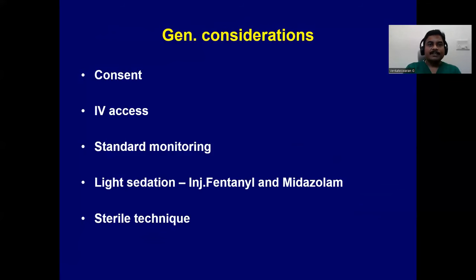So the general considerations are, first you should get a consent, an IV access, and the standard monitoring like pulse oximeter, ECG, and non-invasive blood pressure is needed. These patients should always undergo light sedation with injection fentanyl and midazolam, and it should be an absolutely sterile technique like how we do for a neuraxial block.